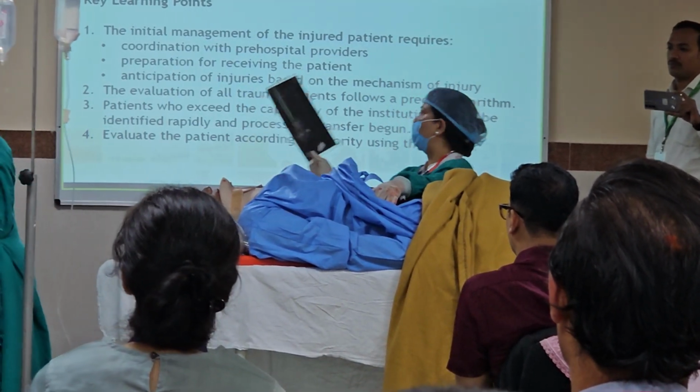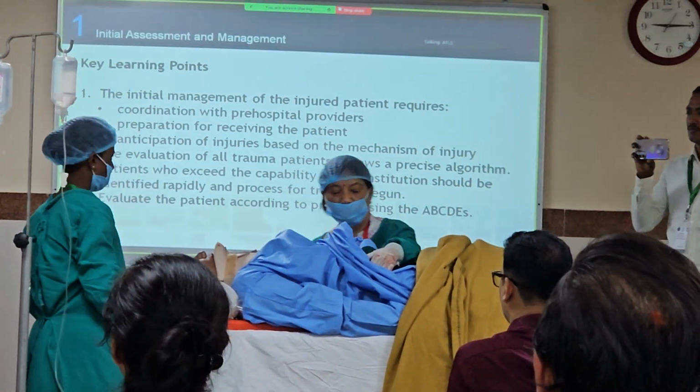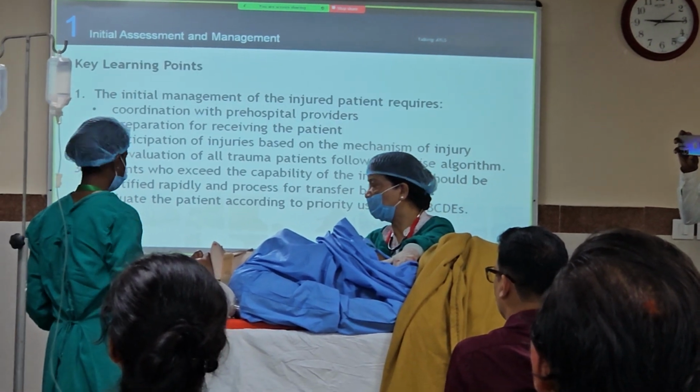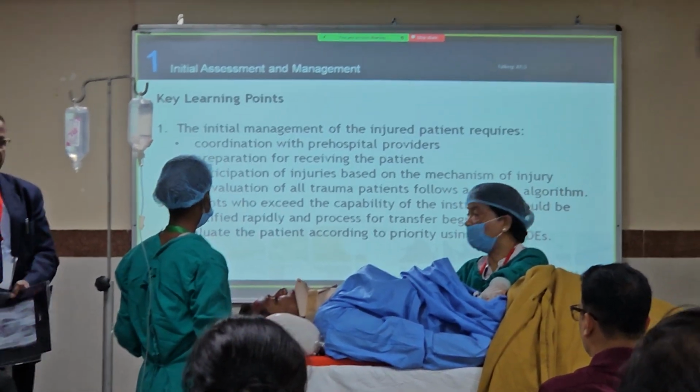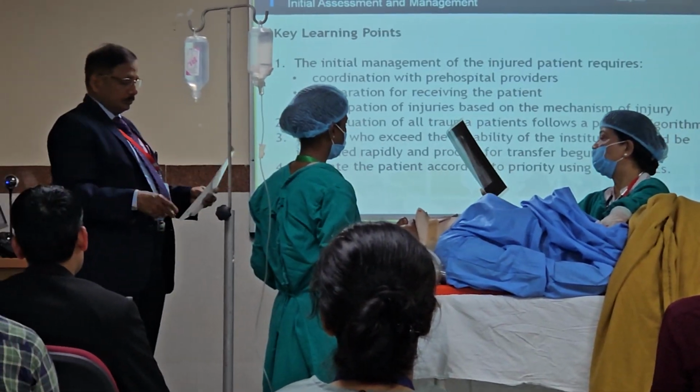So this is the hepatorenal, sir. This is showing normal. There is no fluid out there. I presume there is nothing in the abdomen. What about the pelvis, sir? Do I see any ecchymosis, bruises? You have ordered for the pelvic X-ray and the chest X-ray? Yes, sir. Okay, so you see the pelvic X-ray? Right. So pelvic X-ray seems fine, sir.